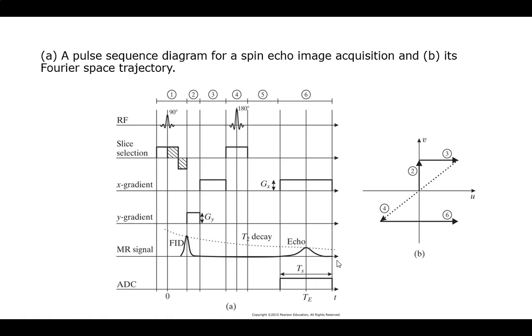If you accidentally kick them with a 180, remember, the bigger the angle you kick something through, right? And realize kick is just a colloquialism, but I think it's a useful colloquialism. The stronger you are hitting it, it's proportional to the angle, right? You get a stronger signal the bigger that angle is. Can I get a bigger angle than 180? Now that's as big as I'm going to actually perturb the system in here. So if I don't do this, yeah, I'll get an echo in mine, but I'll also get a really strong signal in all the others, and everything's going to be noised out.